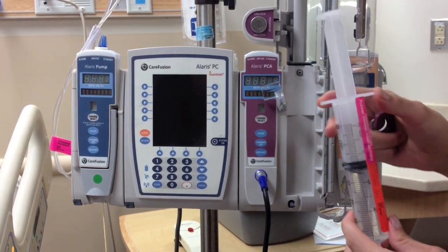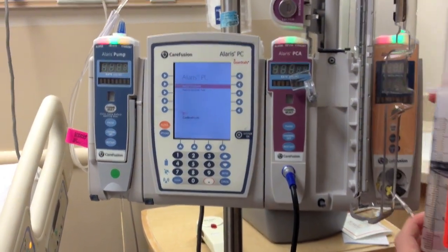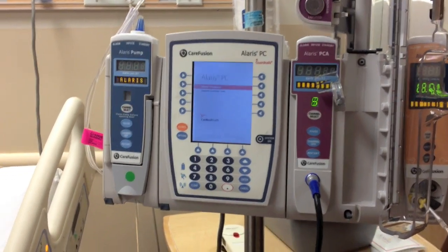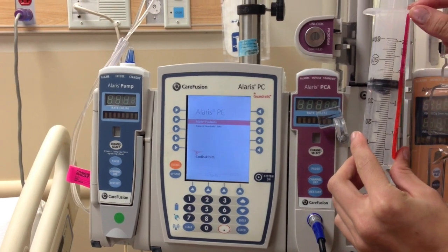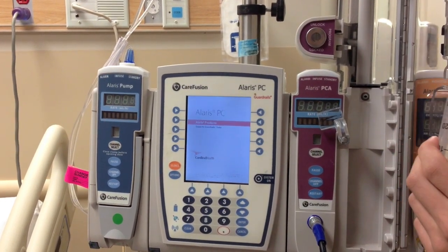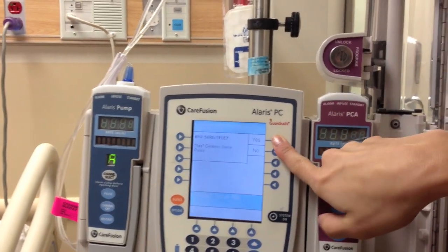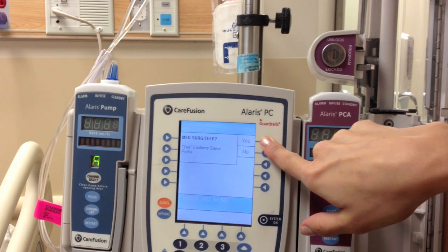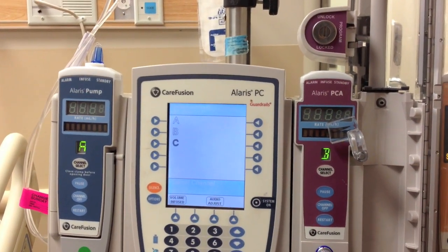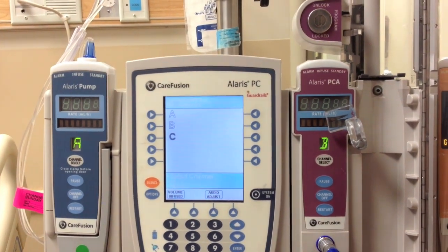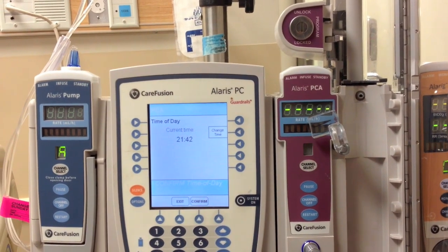Turn on the infusion pump. Select whether this patient is new or old, then select the unit you will be working in. Select the PCA pump channel, then confirm the time of day.